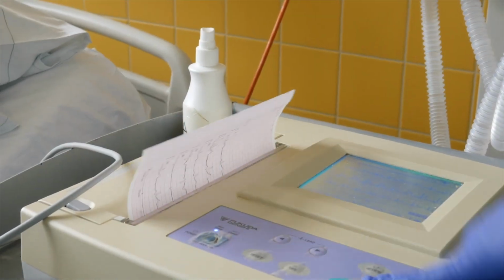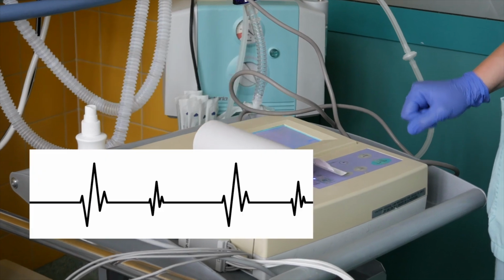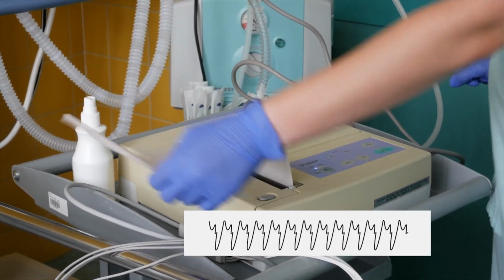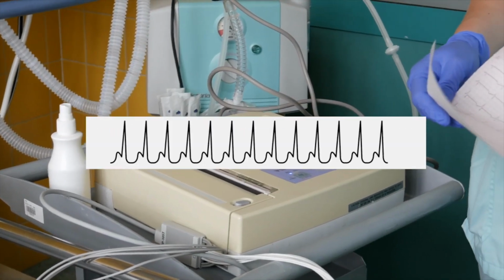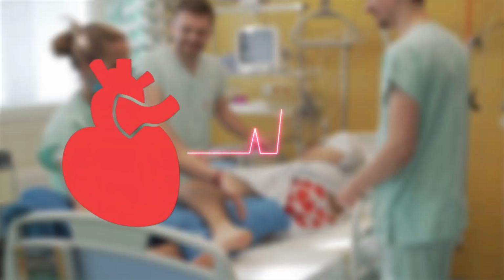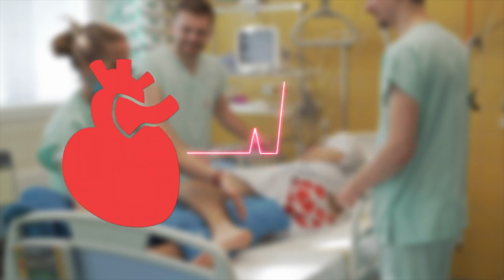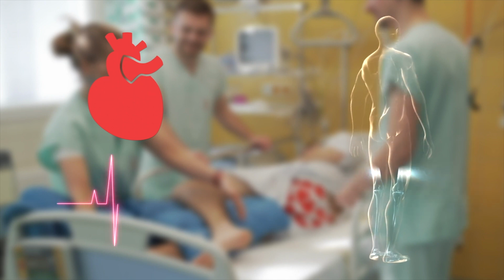An electrocardiogram, abbreviated as ECG, is a record of the temporal changes in electrical potential caused by cardiac activity and is a standard non-invasive method for examining the electrical function of the myocardium. The electrical signal spreads from the myocardium quite easily in all directions throughout the body without being significantly weakened. This allows us to record it with relatively large amplitude in practically any part of the body surface.